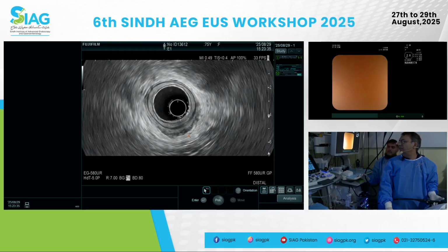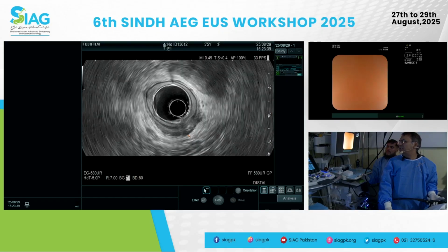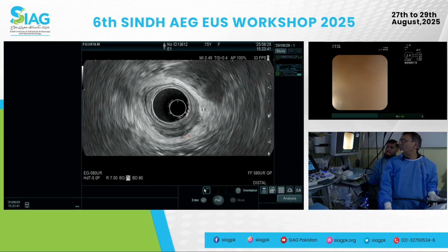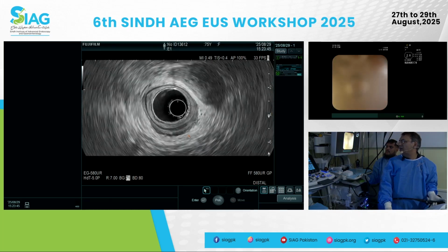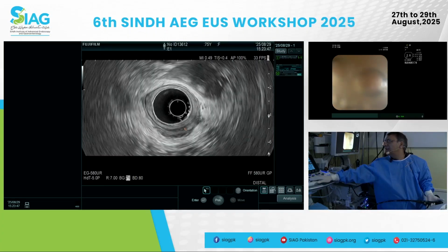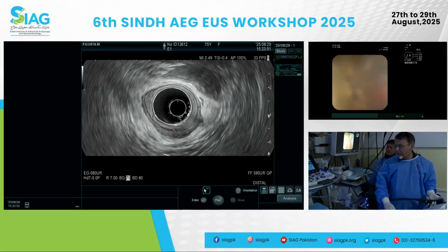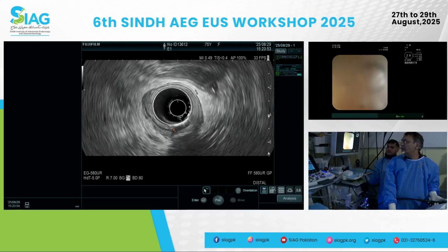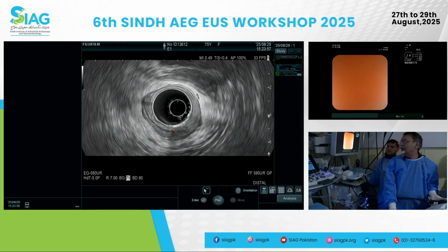The other thing I'm saying is that it's likely wall thickening and inflammation around. The muscularis propria is quite intact there, and there is some inflammation around that area. But if you look at the muscle itself, it's quite nicely intact right there, all around, even all the way up here. So I'll pull that back a little bit.